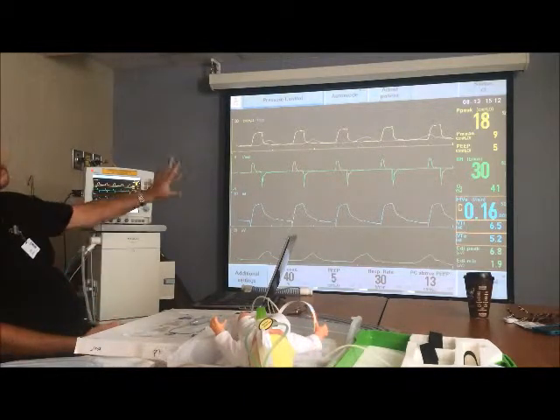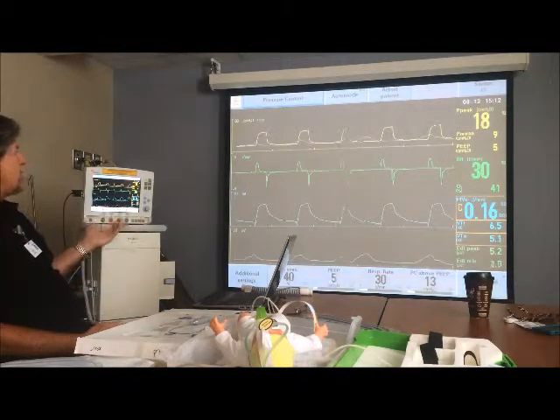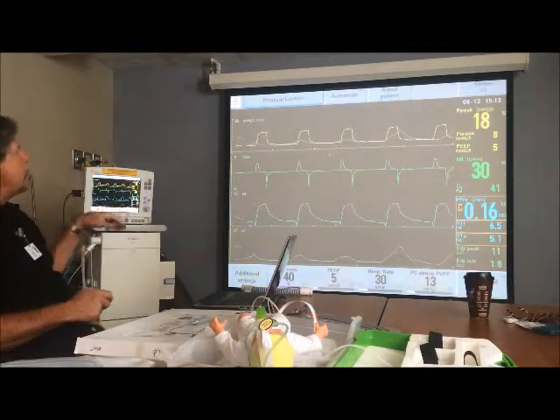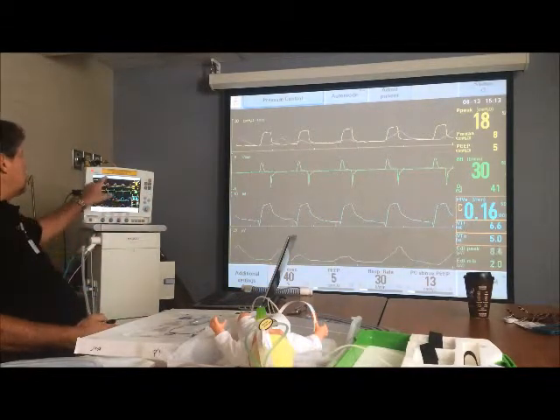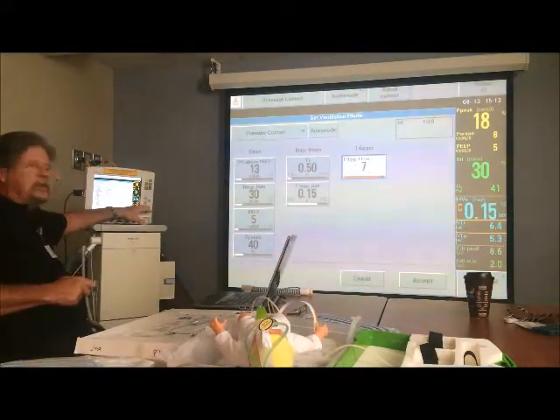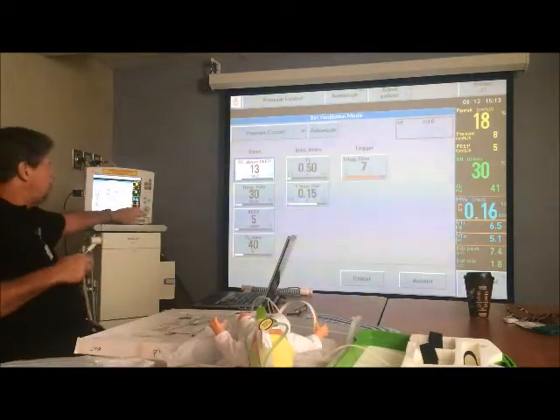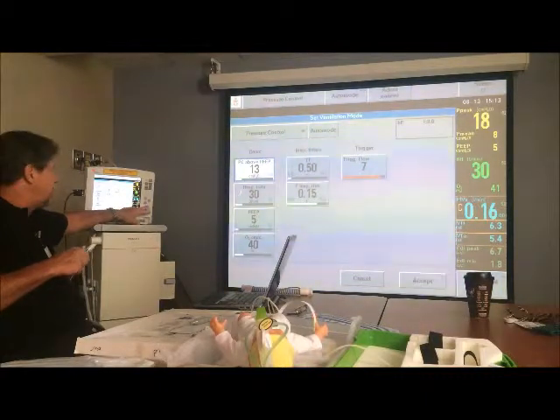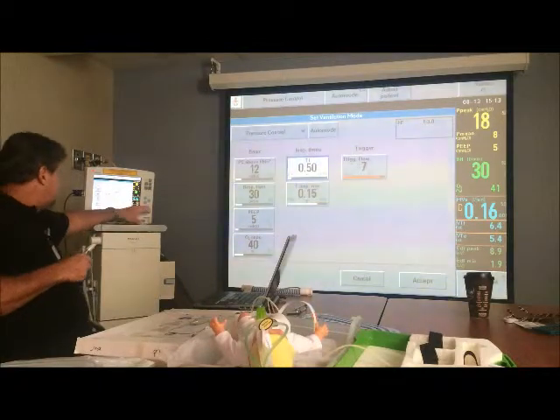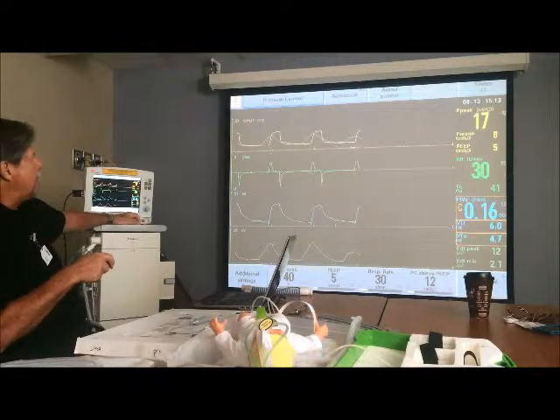So what you could do at this point, if you weren't ready to go to the mode NAVA, is say, well, he's pretty asynchronous, and his blood gases are reasonable here, but maybe we can make him more comfortable by going into the mode and adjusting the eye time or making it a little bit more sensitive. Maybe it wouldn't miss those breaths. Maybe we're delivering a little too much pressure. Maybe we can adjust the pressure a little bit. Just try a couple of things on the ventilator, change the eye time, and then go here and say, how did we do? Did we do any better?